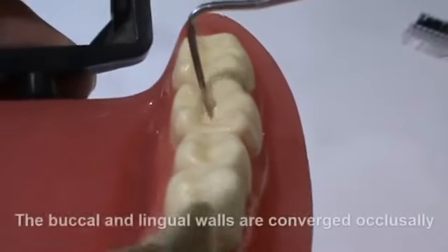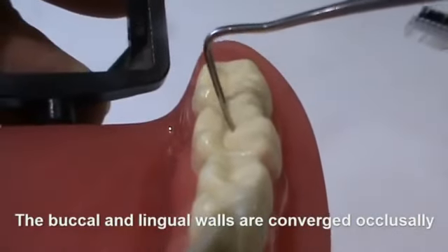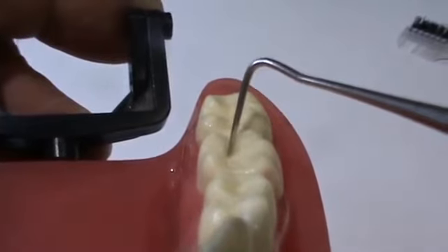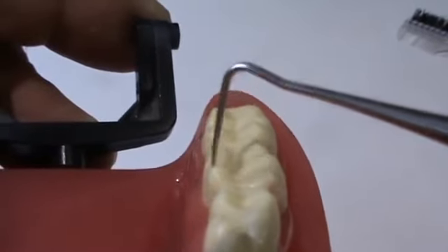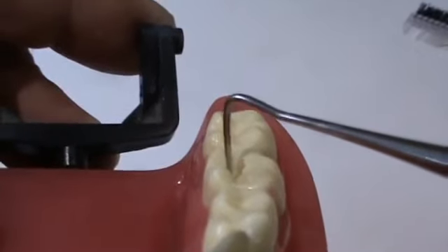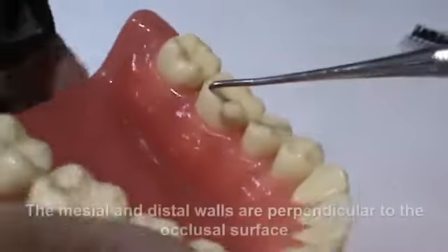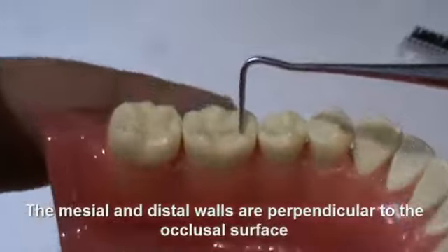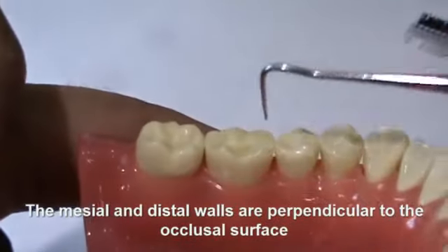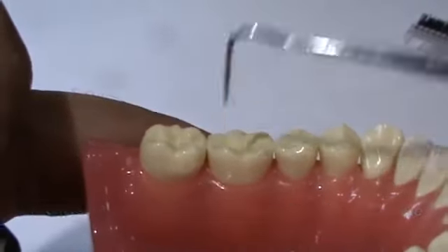The wall, buccal and lingual under the cusps must be converged occlusally, while the mesial and distal wall at the marginal ridges should be perpendicular or slightly diverged.